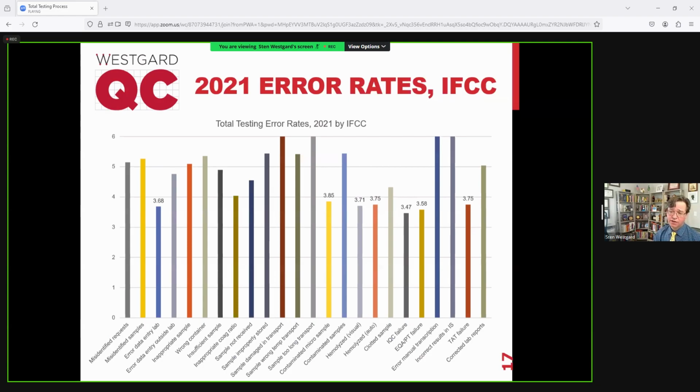They have specifics on single tests for their turnaround time, and those can often be quite low, but for ones that are more lab-wide, you can see I've put the numbers on the worst error rates.